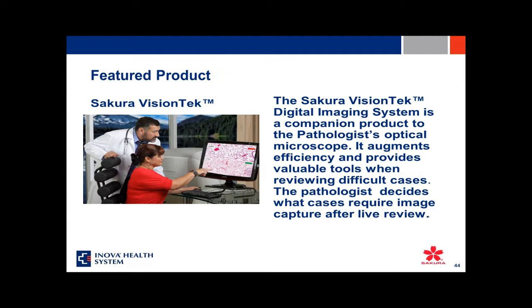Okay. Thank you. I have another question. How would you validate a newer technology like the dual ISH that has been FDA cleared? Would you be able to talk on that? Yes, for an FDA-approved assay, our recommendation would be using 20 positives and 20 negatives. Cases that would be positive would be amplified, and cases that are unamplified would be negative. So we would use 20 positives and 20 negatives for an FDA-approved assay. Okay, thank you.